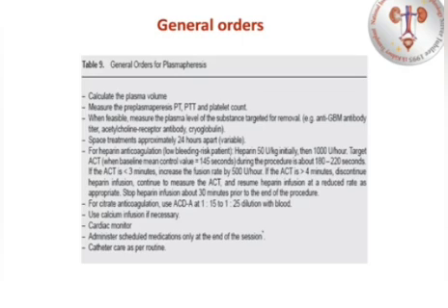Space treatments approximately 24 hours apart. Sometimes, in some other indications, you might do it every other day. In some, you perform a few sessions daily, the first 3 or 4 or 5 sessions, and then you do every other day sessions.